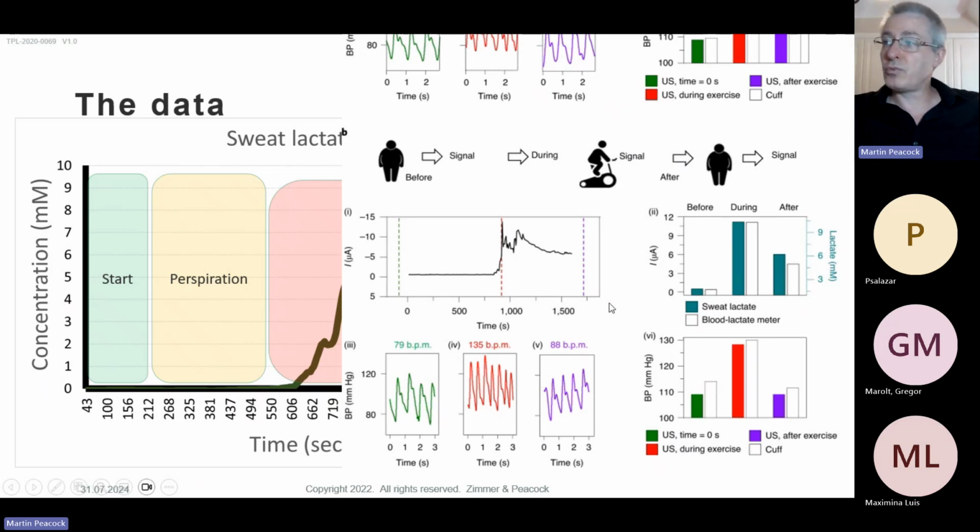But when I looked at the Joseph Wang paper, I actually saw the same dip. He shows current. I think if he was using the Dooley SensiOR platform, he could have displayed it as lactate, but he shows current. There's a dip in the data, and then it comes back up again.